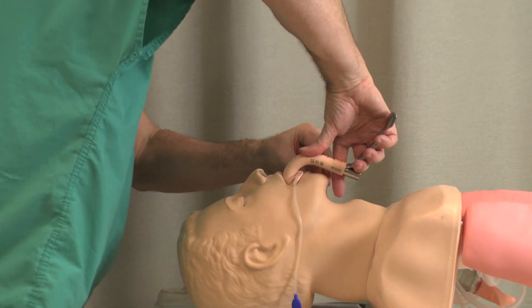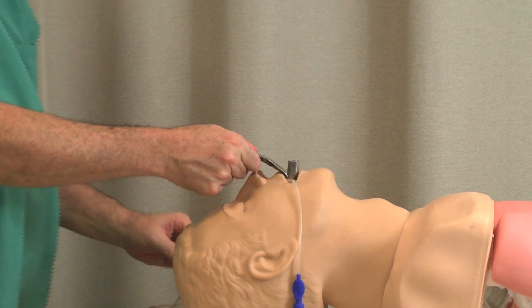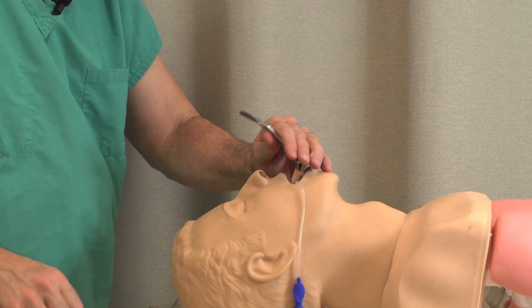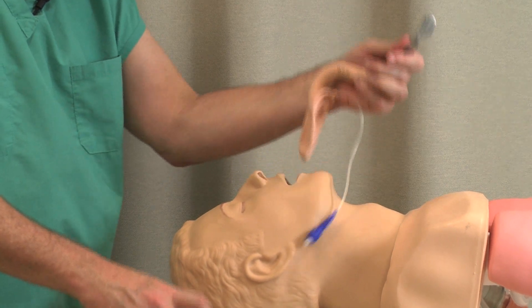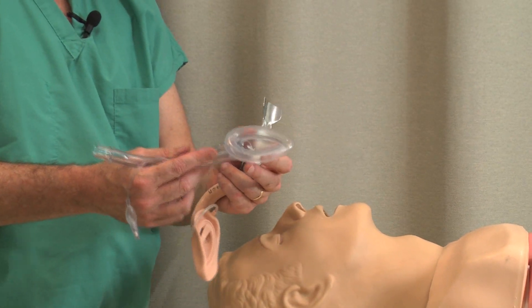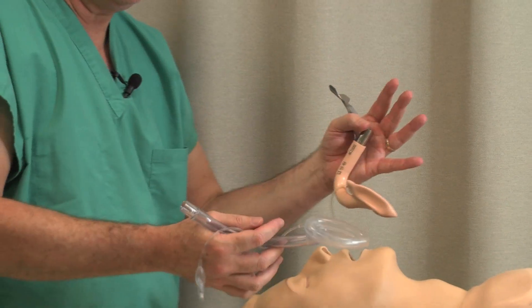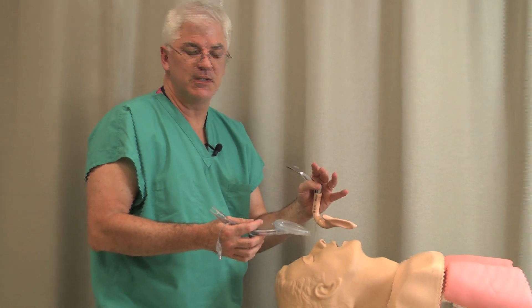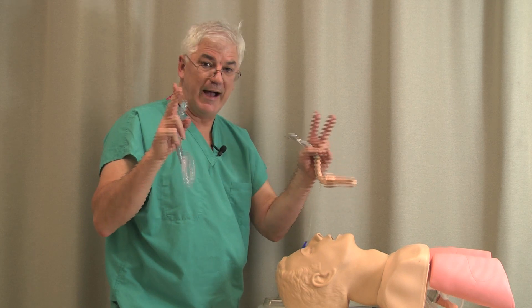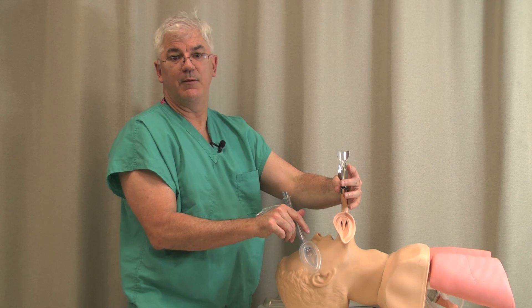I'm going to put this thing in, and then go like that. Through this, I can pass an endotracheal tube or a fiber optic. In the ICU realm, you may go a long time not using an LMA, but you want to always make sure it's part of your equation. If you're not able to get enough oxygen into someone and you're not quite able to intubate them, or you need to buy time until the fiber optic or someone else arrives, definitely think about using an LMA. Now we're all going to put it in.